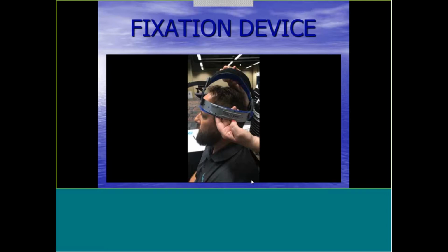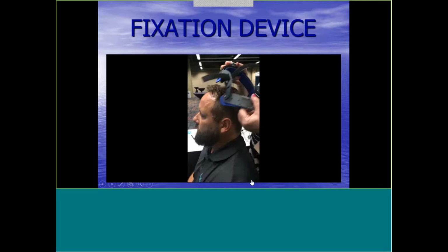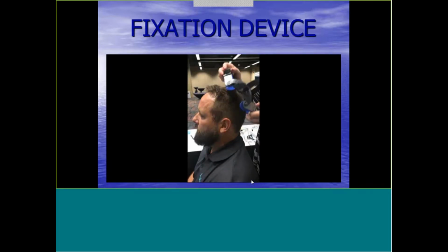Sean, are you doing all right? Okay. The next thing then is to make certain that you tighten this black Velcro strap, and we have the headgear properly placed on Sean. Okay, we're going to go on.